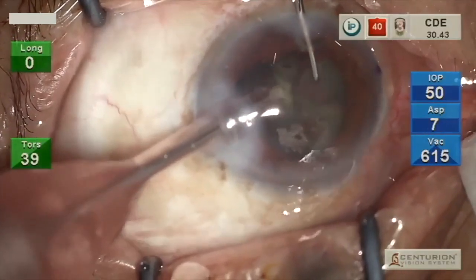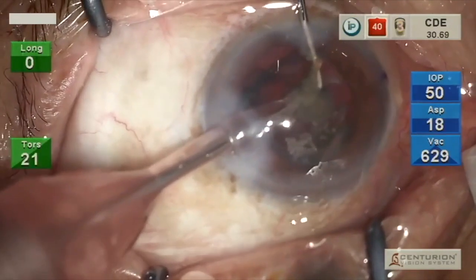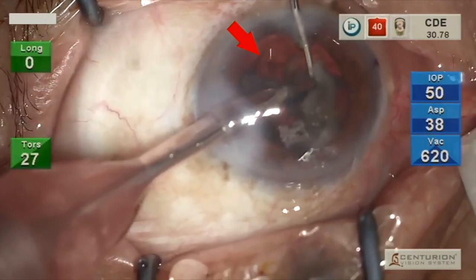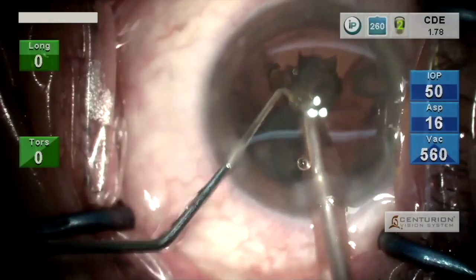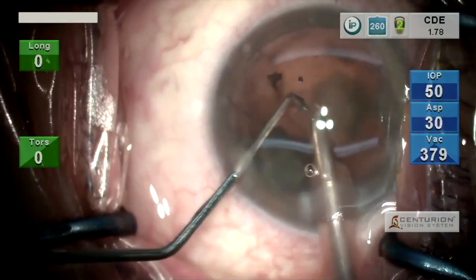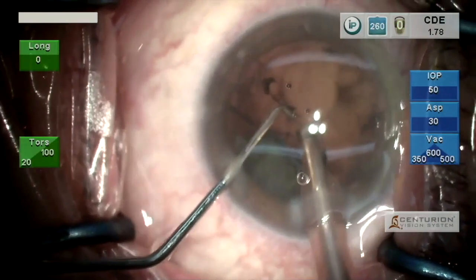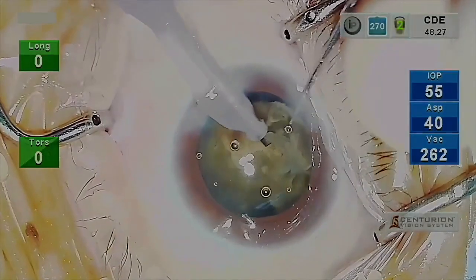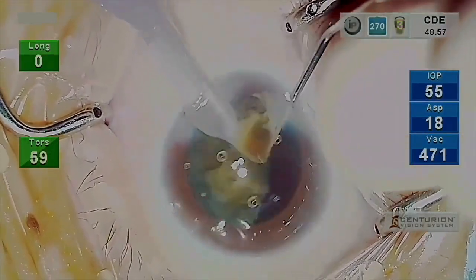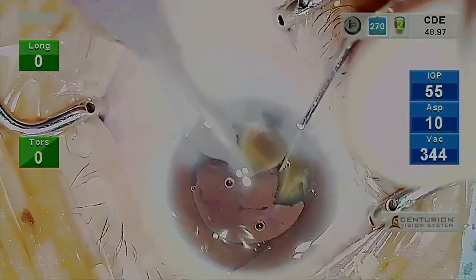Nowadays, phacoemulsification is the most commonly performed cataract surgery in ophthalmology. However, despite tremendous technical and technological advancements, posterior capsular rent (PCR) still occurs. Although several factors can contribute to PCR during phacoemulsification, one of the crucial factors is the surgeon's experience.